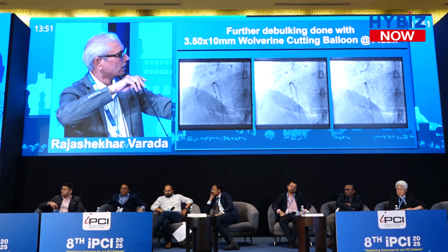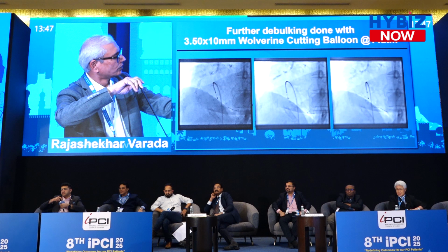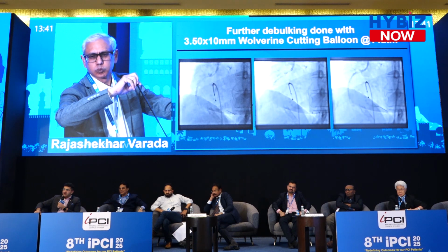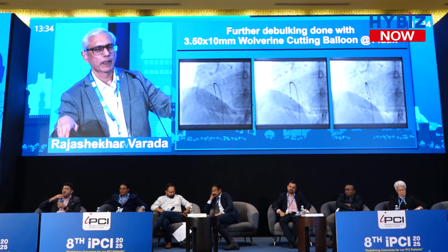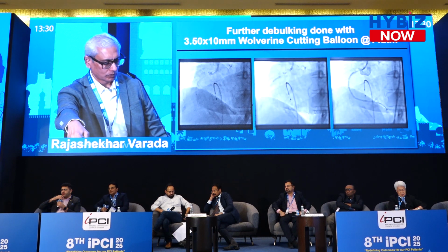I agree with Dr. Kasturi. You see, there were reverberations in the tightest part. That means the thicker part has been shaved off. Yeah, it has become thin now. Now easily it can be cracked with an NC balloon. You see, there was enough indication that rota has done a good job at the tightest part. I agree, there was some part where rota didn't touch, but the tightest part, the thicker part, has been shaved. That's why we see reverberations. The surface has become smooth.